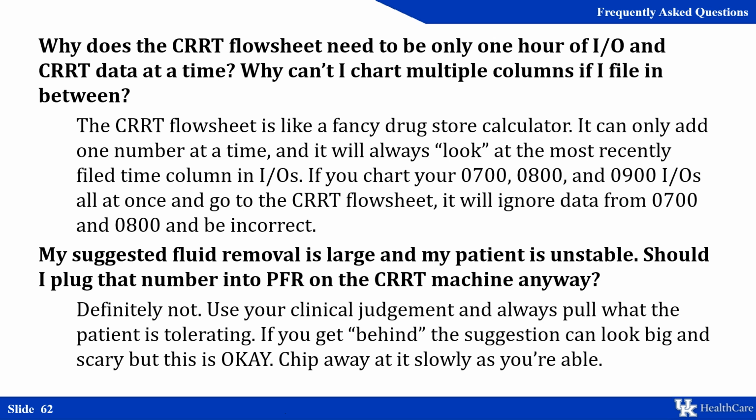Next question is, my suggested fluid removal is large and my patient is unstable. Should I just put that number into my PFR on the CRRT machine? No. We want you to pull based on your patient's condition. Remember, some patients, as they get sick and we add on additional antibiotics and other medications, can start to build up quite the running deficit. That's okay. Once our patient starts to get a little bit more stable, we want to start slowly pulling at that fluid as we can.